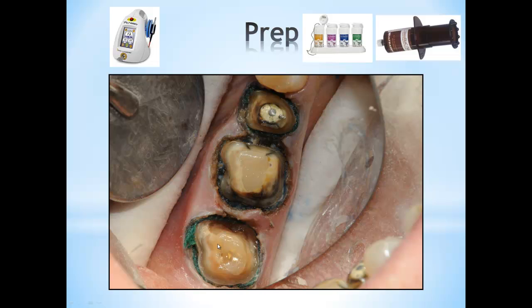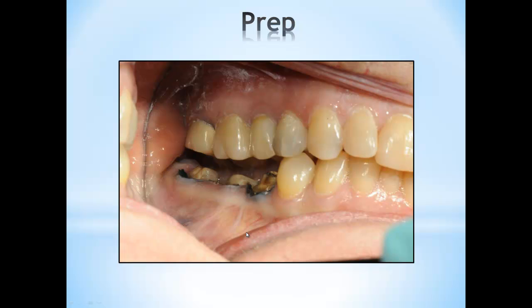In this case, once again, you can see my cord almost at the bone level. I'm not sure, so if we had a biological width violation, we might do a crown lengthening technique, but we probably might get away from that. The preparation was done, and from the buccal view, I have enough clearance in this case, so I'm not worried that the restoration will be jeopardized.